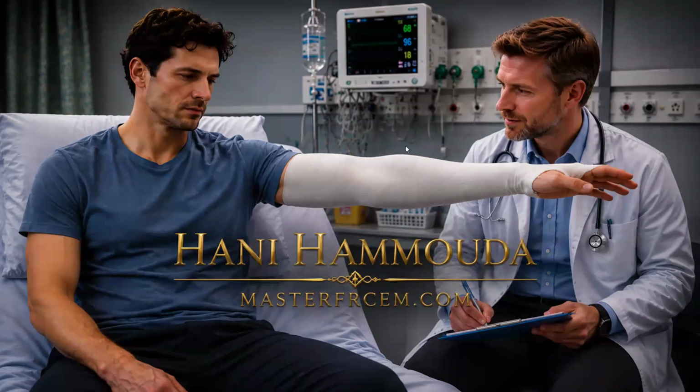What are the landmarks? Elbow to metacarpophalangeal joints. These are the real landmarks. These are the actual landmarks. So stockinette, it will be 10 centimeter above the elbow, 5 centimeter below the metacarpophalangeal joints. Clear? Don't cover the fingers. Done. First step, very easy.